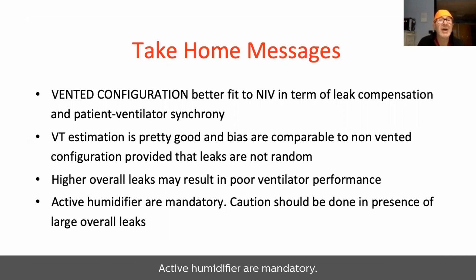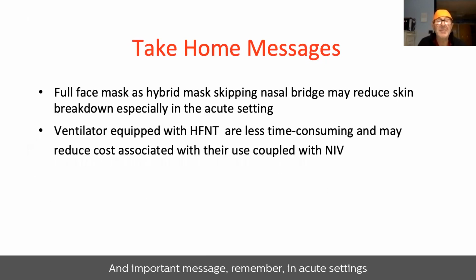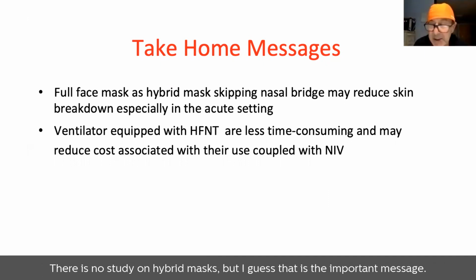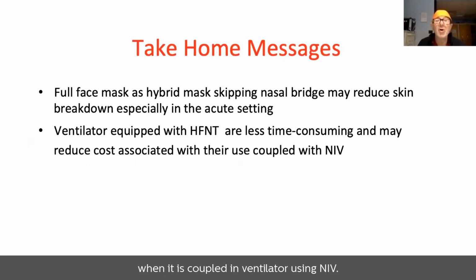Heated humidifiers are mandatory. This is absolutely important to avoid problems related to mucus plugging, especially outside of COVID viral pandemics. An important message, remember: in the acute setting, there is the possibility to use not only a full face mask, but also a hybrid mask. There is no study on hybrid masks, but I guess that is an important message. I strongly believe hybrid masks are a very important tool. In addition, I want to conclude that high flow nasal therapy is not a gadget when it's coupled in a ventilator using NIV. Thank you very much for your attention.